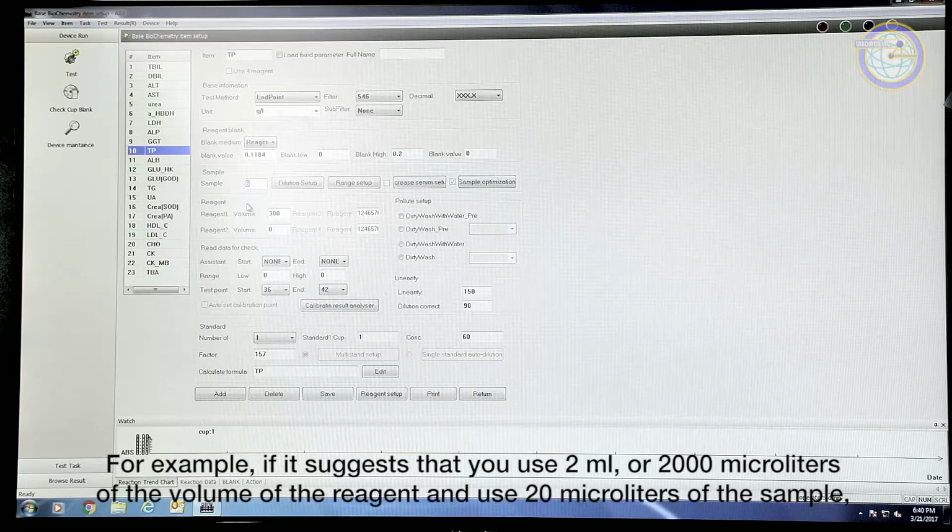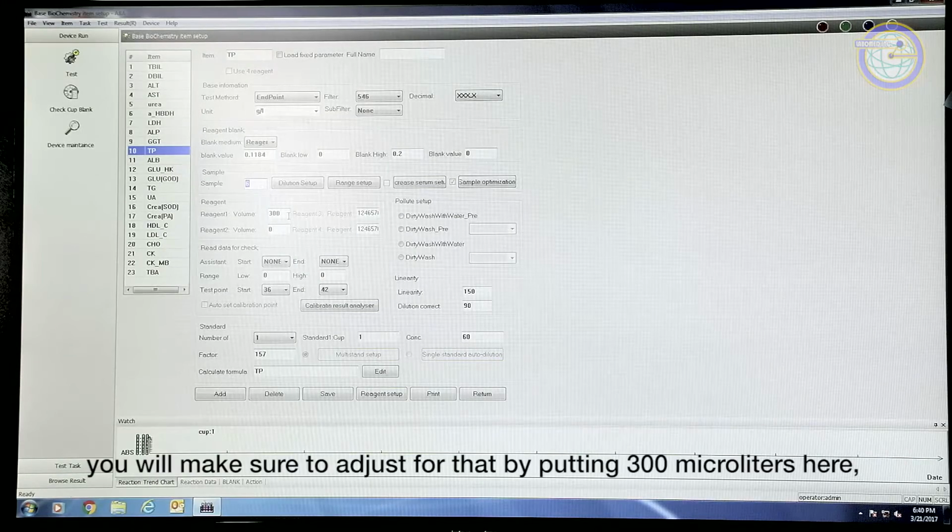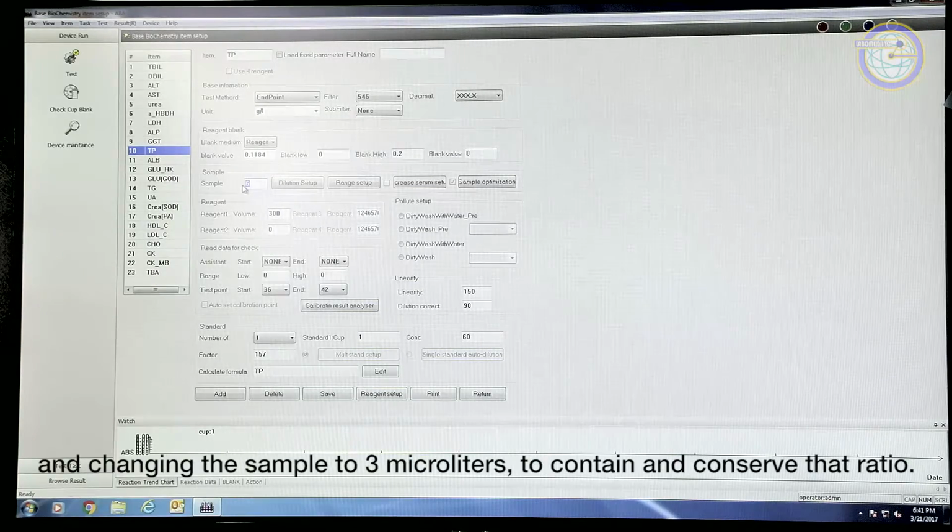For example, if it suggests that you use 2 mils or 2,000 microliters volume of reagent and use 20 microliters of sample, you will make sure that you want to adjust for that by putting 300 microliters here and changing sample to 3 microliters to contain and conserve that ratio.